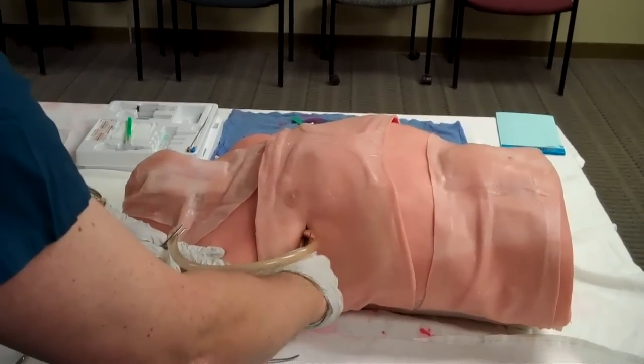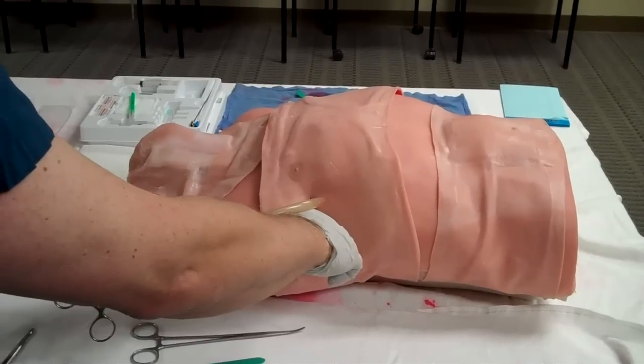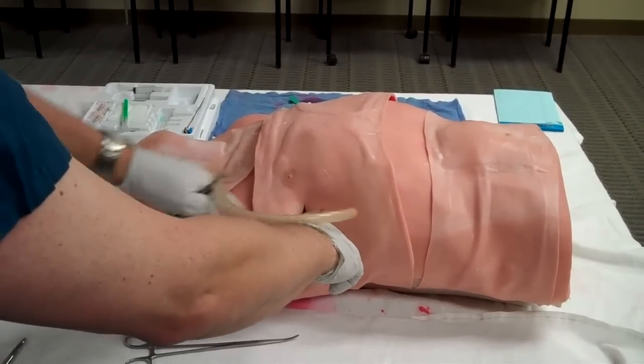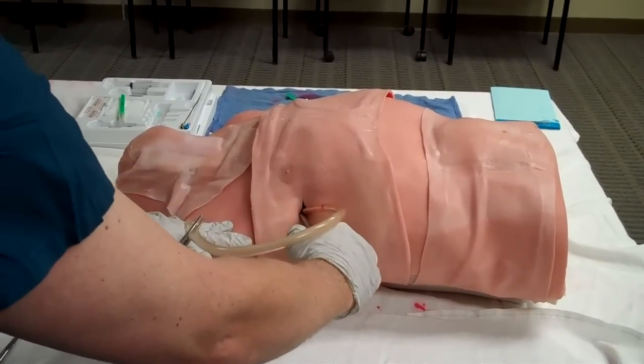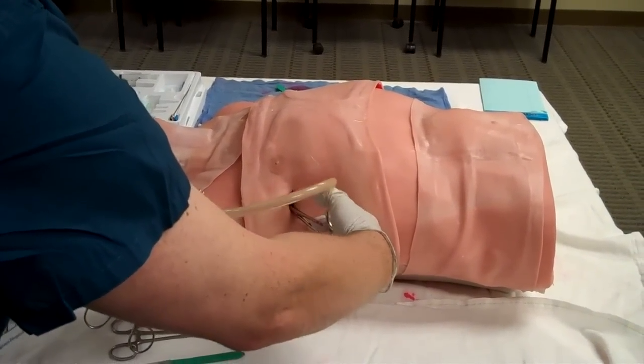and then through your hole in the pleura. And one of the other advantages to putting your finger in through the chest is you can feel where that hole is in relation to the skin, memorize where it is, so that you don't have to try to stick another finger in at the same time to figure out where it's going. Now, I like to direct these upwards, so I'll just gently push it upwards with my instrument.